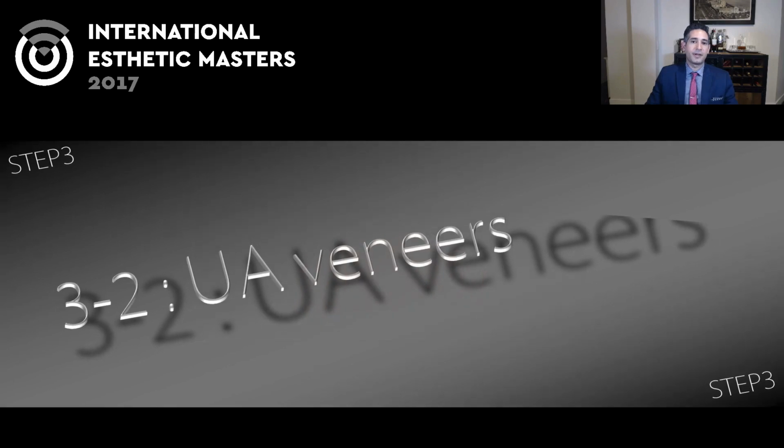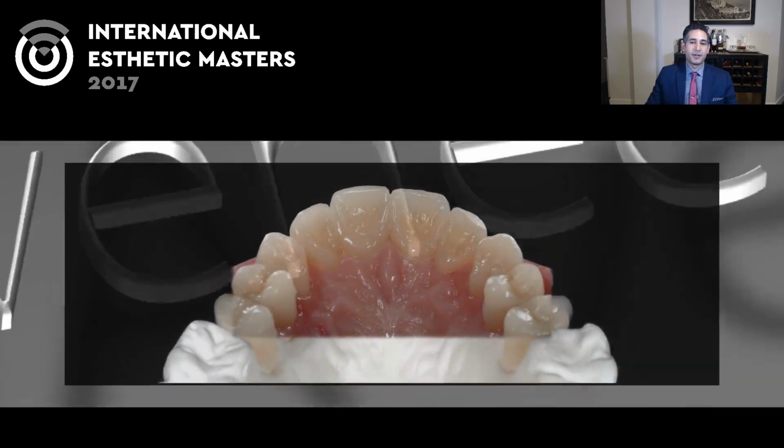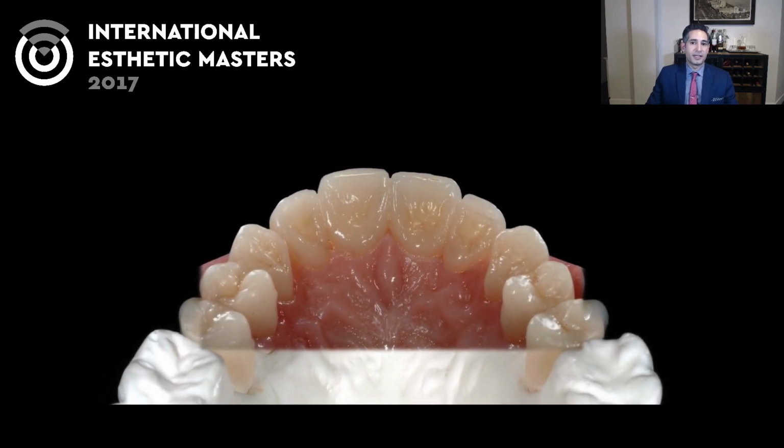Now, let's go back just for a second. At this step, the patient has the anterior step 2 completed, which is having the palatal surface restored. They have the posterior mock-ups in place that we created in the previous step as well. So there's everything done. It's actually step 2 and step 3. Step 2, posterior mock-up. Step 3, the anterior palatal mock-up, and they can test their full function.